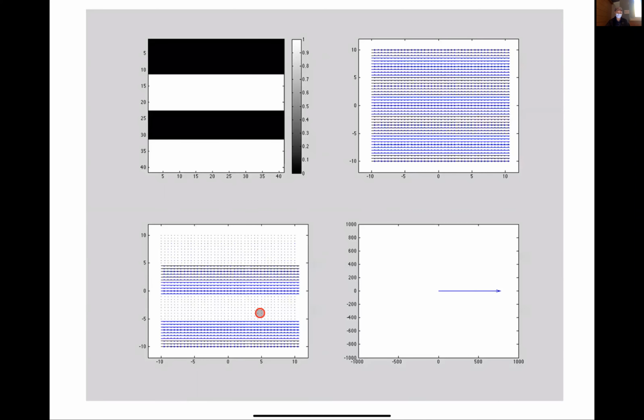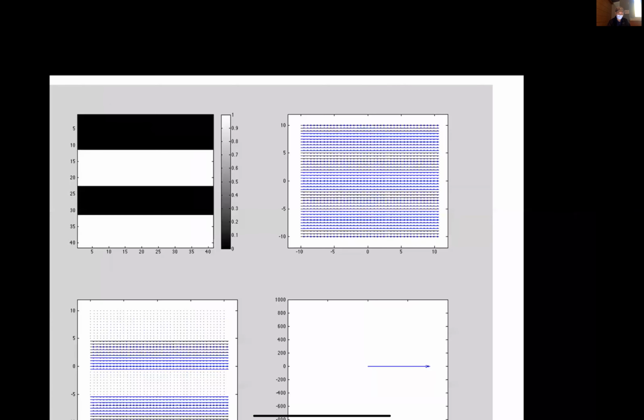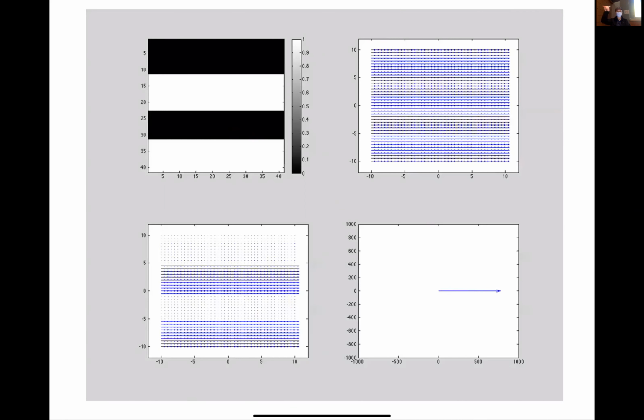Okay, so we're going to go through this movie and watch how things go. We'll go through it quickly first, and then step through it more slowly later. Right now we're at the center of K-space, and all the spins are aligned in the same direction. If you download the movie and look at it there, hopefully it'll be at a slightly better resolution.